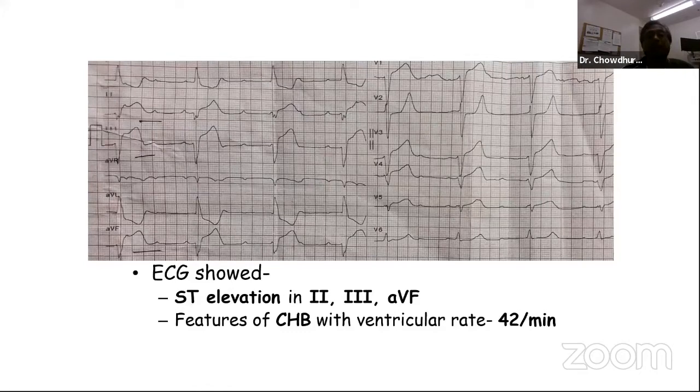Probably not, but overall, given the coexistence of the heart block and the clinical story, I would not even doubt that this is a STEMI. Hafiz, you are making a valid point that we have been talking about for the last 3 sessions, that the most important part is the clinical scenario of the patient, and to make a judgment based on that.